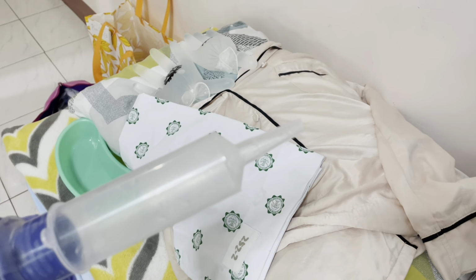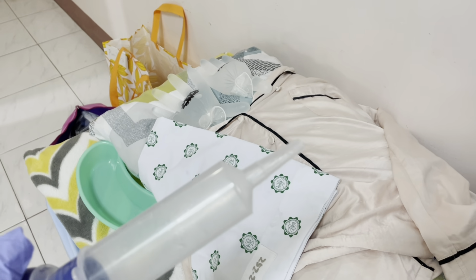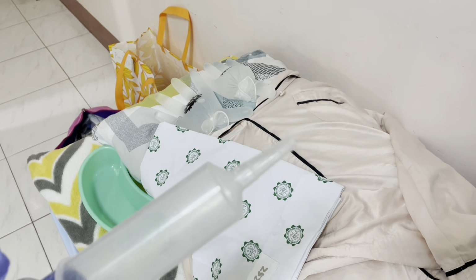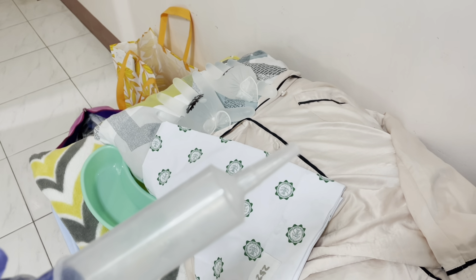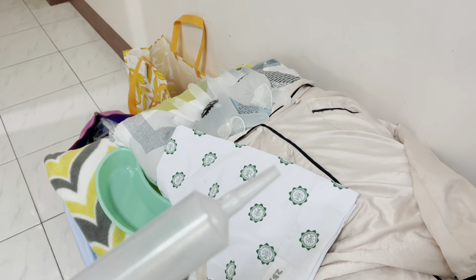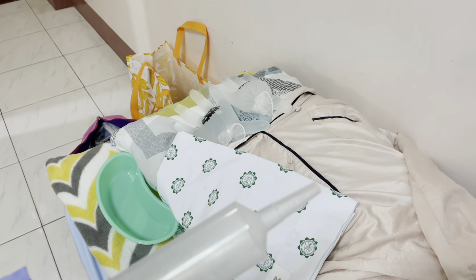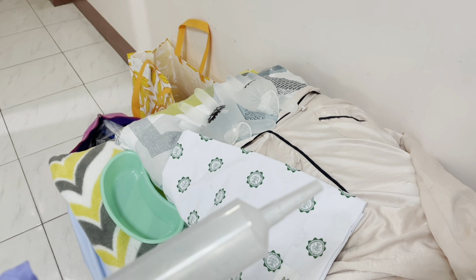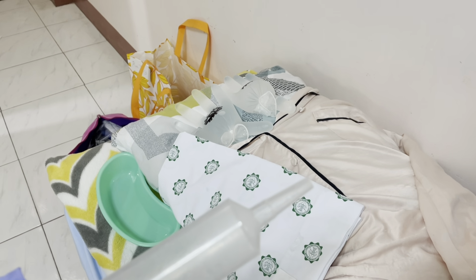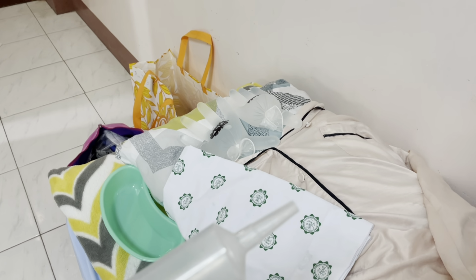So here what we're going to do is we're going to hold the irrigation syringe for about half an inch above and away from our patient's eye, and we have to gently irrigate the solution from inner to outer canthus. This is to administer the solution slowly and to remove the particles properly. Then we are going to redo the irrigation until we will be able to achieve the desired result or the total amount of solution has been used.